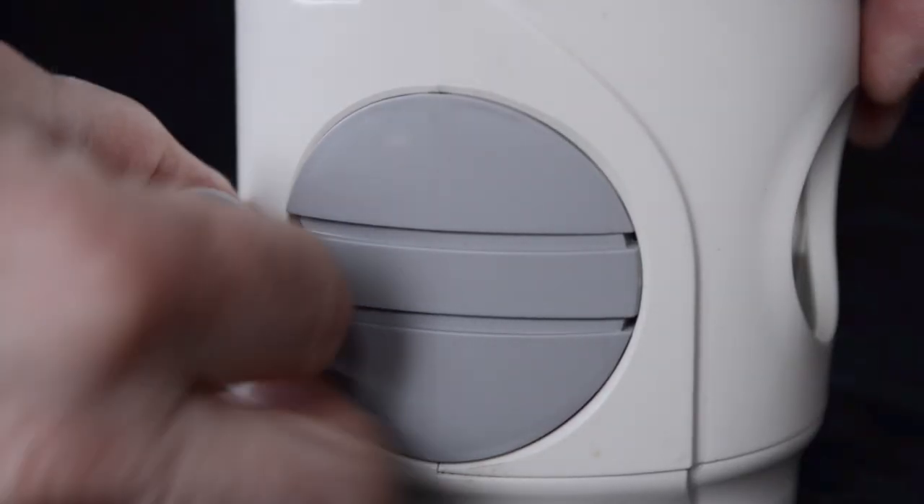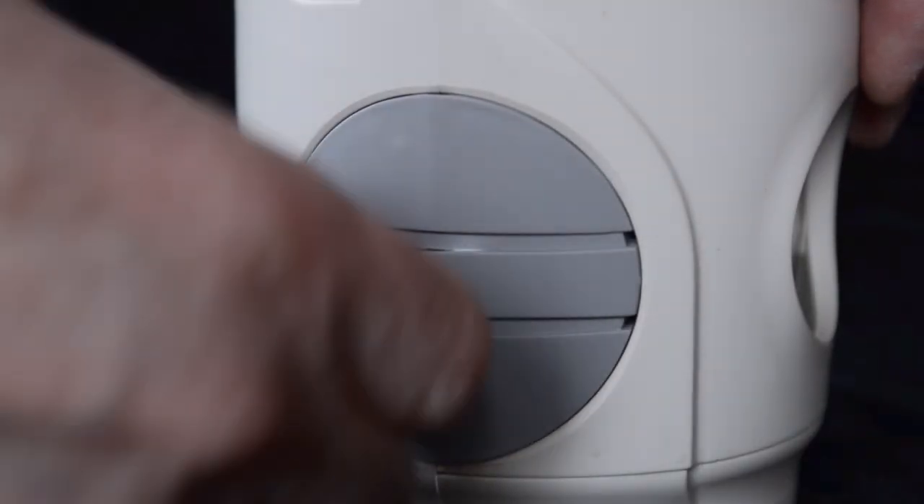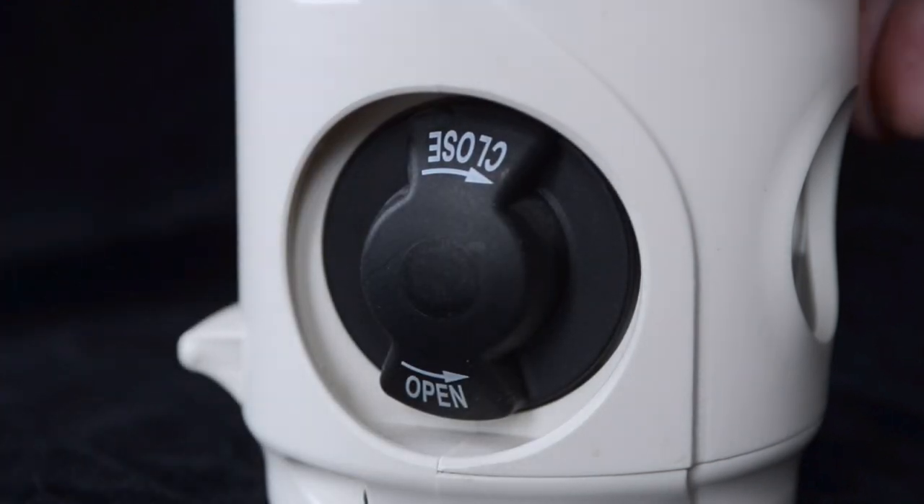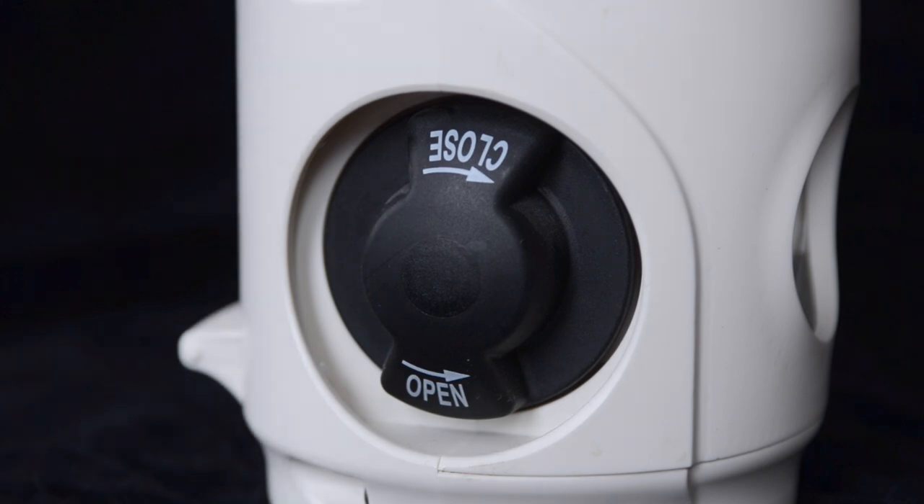Remove the tamper-evident hand wheel cover by pulling the tear ring and discard into a recycle bin. If the cylinder has been used before, this cover will not be present.